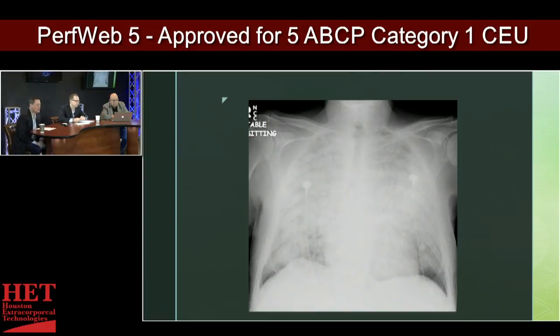This is a little bit more consistent with what we see clinically, with what you guys do and what I do. ECMO. Can we get this guy off? Call Stephanie. Stephanie, she didn't approve my meeting. ECMO. This is what CEUs would obviously teach you to understand and identify.